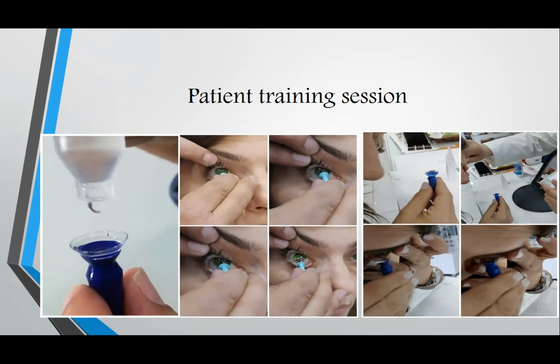The first criteria, the three important parts. The first one is the lens parameter. Make sure you are doing the correct lens parameter, and then the sag, mid-periphery, limbal zone, and the landing zone. The second part, the refractive power. Make sure to evaluate the refractive power correctly.